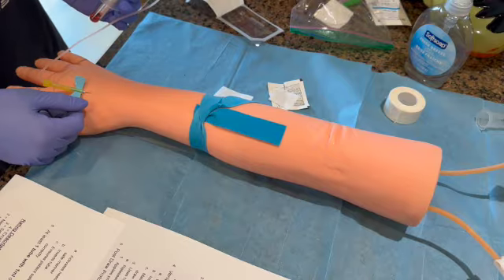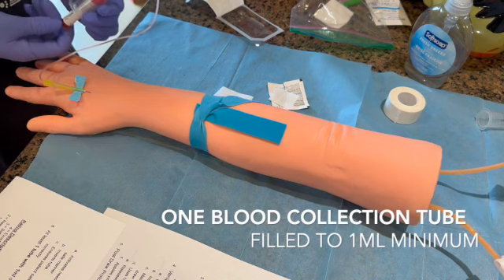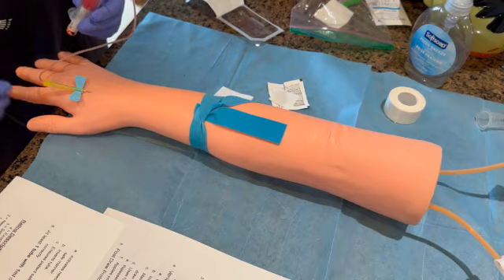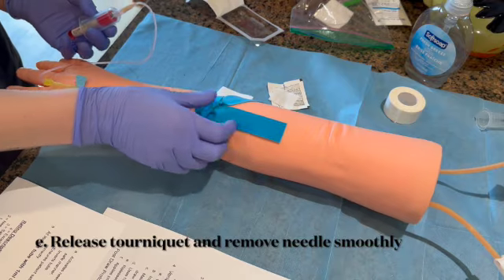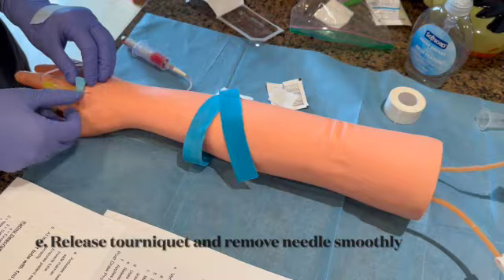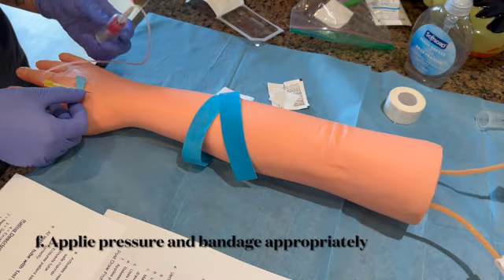Good, we got adequate blood flow this time. I don't know why I can't get that to happen with the straight needle. But we're going to make sure that we're collecting at least 1 milliliter of blood. This is where the 3 milliliter line is. I would say at this rate, with this particular tube, we're probably at the 1 milliliter. So if you were having trouble with it, you could always end the phlebotomy here. I'm going to attempt to pull everything, so I'm going to then remove his tourniquet, make sure this stays, and we're staying in nice control. And we're seeing when we're at capacity here, and I would say we're probably good.